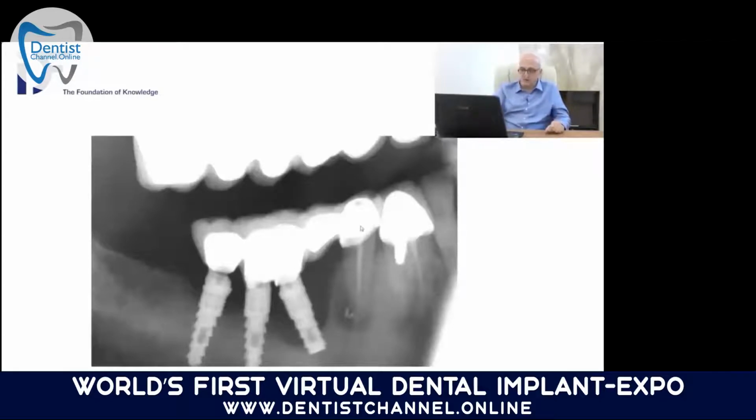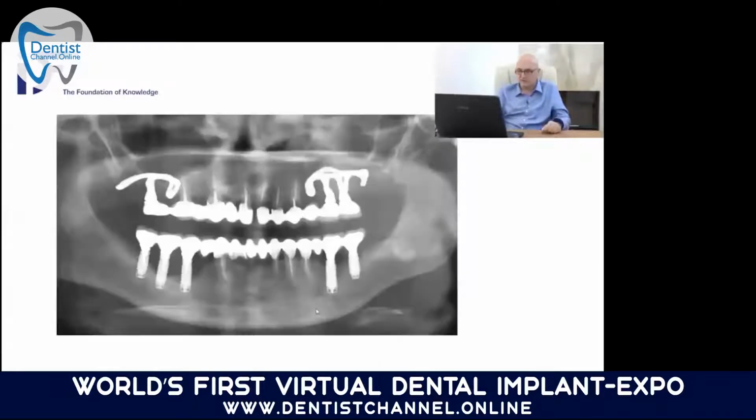There are some doctors who like to connect implants to natural teeth. We don't do this. I mean, we do this in very, very rare cases if we have no other possibility. Because, of course, these implants are osseointegrated, so they are stiffly connected to the bone, and this tooth has inborn elasticity from the desmodontium. So this is, anyway, I would say, not a very fortunate case.